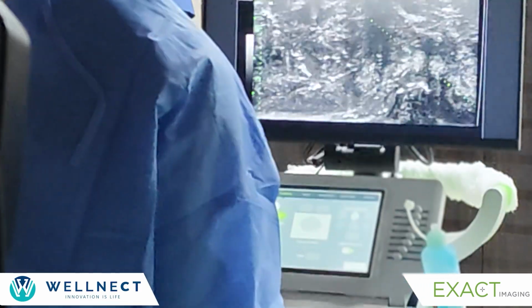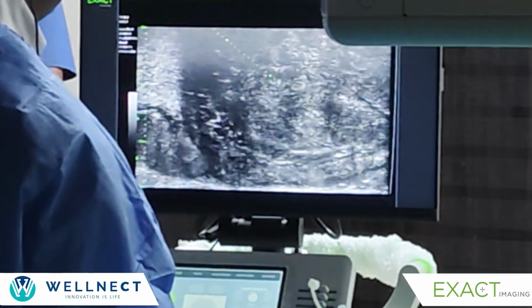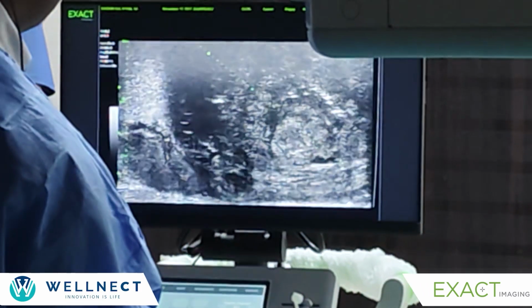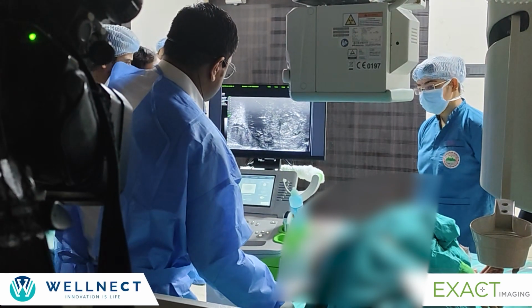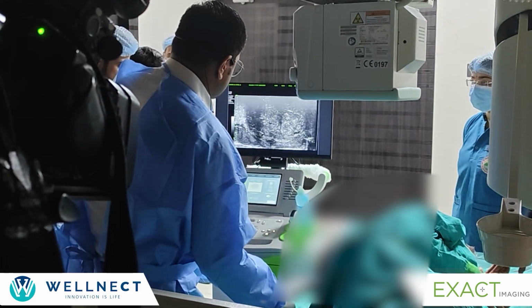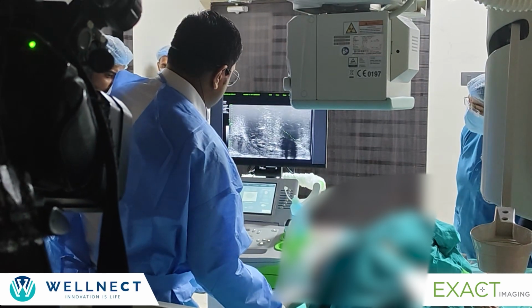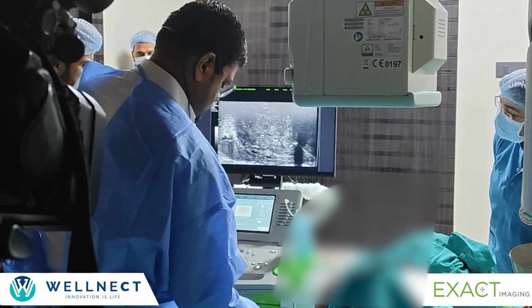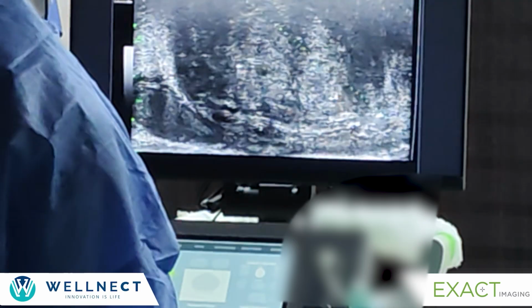Now I still come over here since I know that the disease is on the right side. I will look at this mass. So this is the mass that I would target. Now I am taking, suppose, a targeted biopsy. So this is what I am interested in. You see, it's a complete mass which is seen. So I will come over here, definitely come over here, slightly here, and then this is the mass for which I will go. So if I label, this is the targeted biopsy.